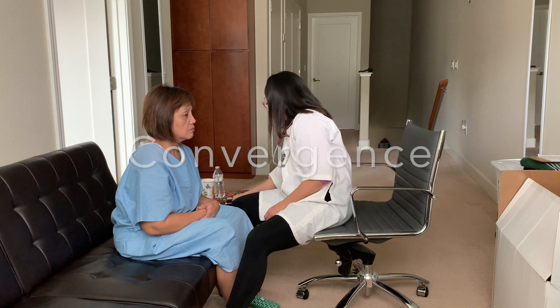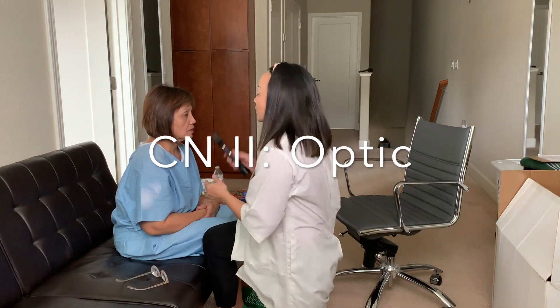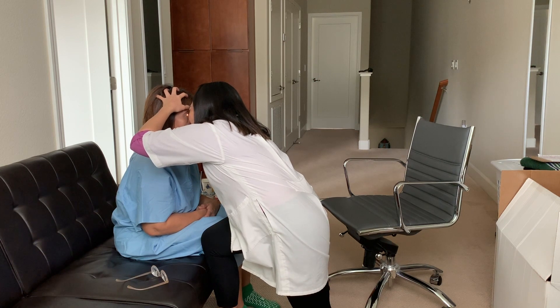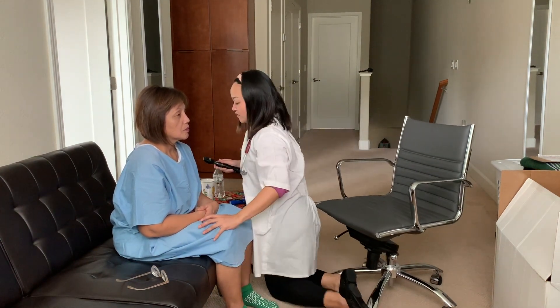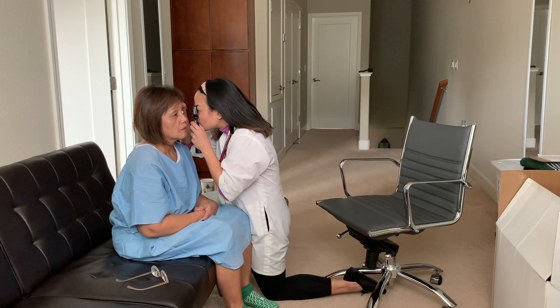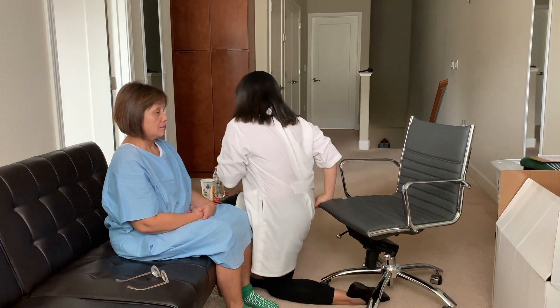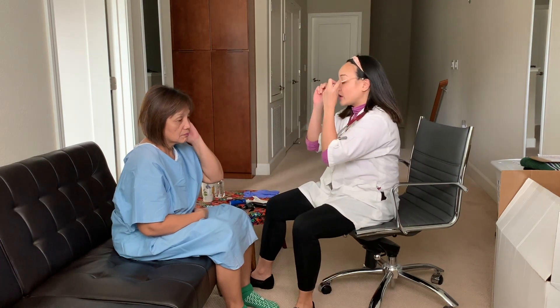Now we're going to do a fundoscopic exam to check optic nerve two and three. Looking for the red reflex and going in. Looking at the physiologic cup, the arteries and veins, and the macula. So now we're done with the eyes.